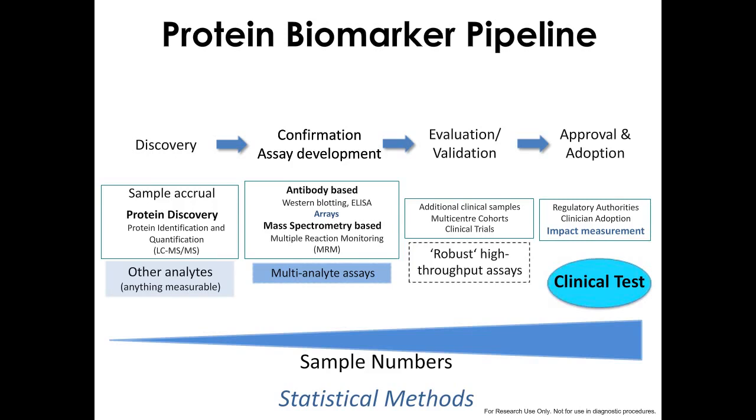This just shows a version of a process that many people have adopted to try to get to biomarkers that may be of clinical value. Of course, the end point of all of this is a biomarker that will result in a clinical test. And I'm just trying to draw an arrow here to highlight that that's a clinical test that will be the output of all of this work.